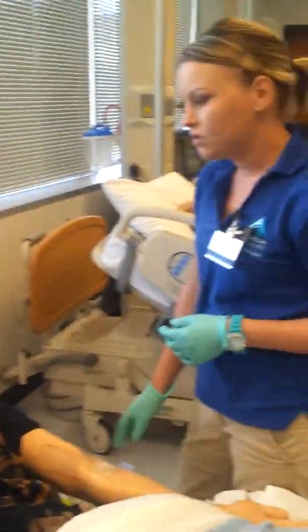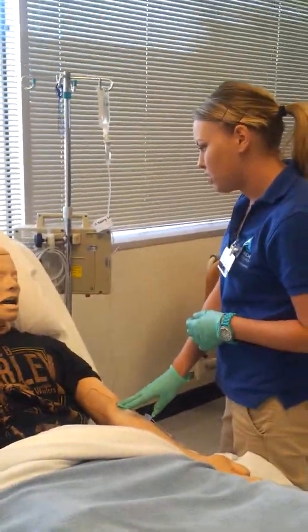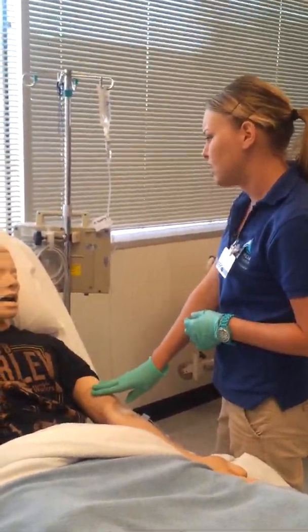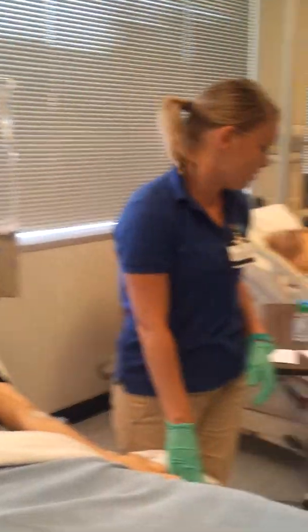All right, Mr. Johnson, this will take about an hour to run and I'll be back in about an hour. If you notice any pain, tenderness, or itching or anything at the site, please let me know. If you start to feel anything abnormal, let me know. All right. Thank you, sir. So then I would leave the room.